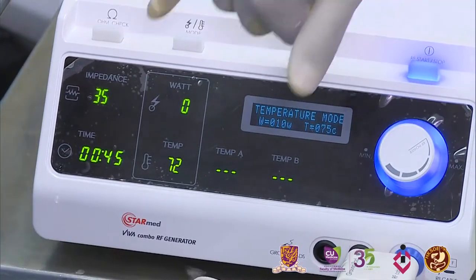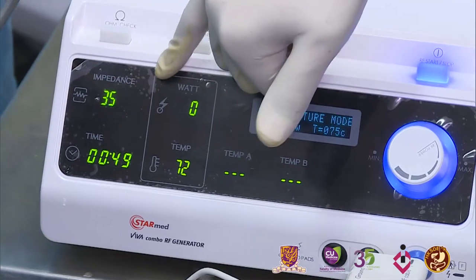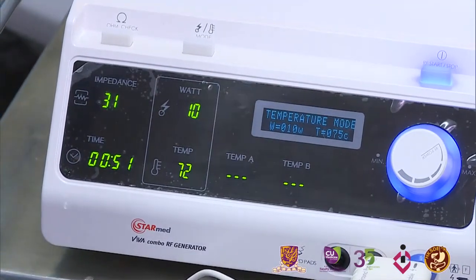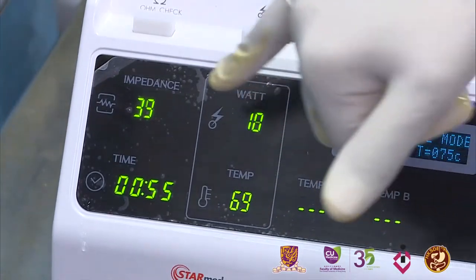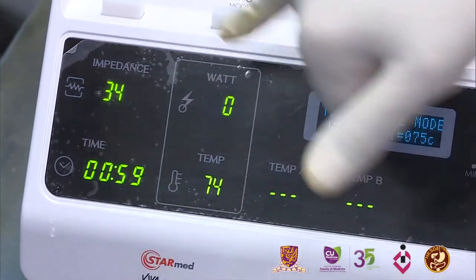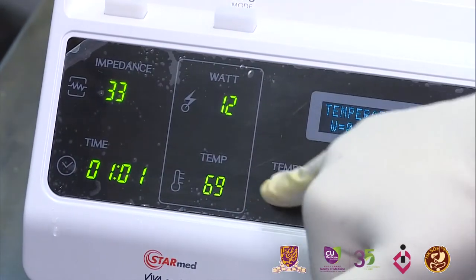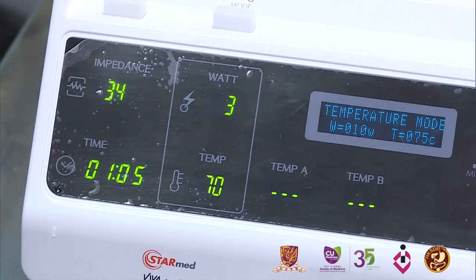The other thing I like about the machine is the impedance here. You see, the impedance also is measured. If the impedance is very high, you know that it's not properly placed. It's probably too much into the bile duct. You have to get it down. So impedance, the time, the wattage and temperature, these are the four things. And always look at the temperature all the time, that you're maintaining 70 degrees. It's slow cooking, a dim sum kind of cooking, right.